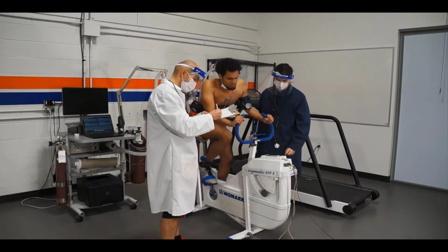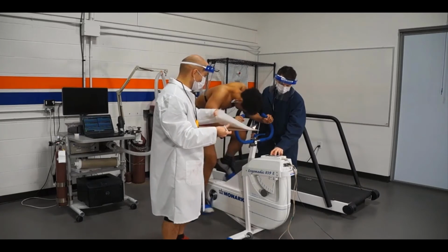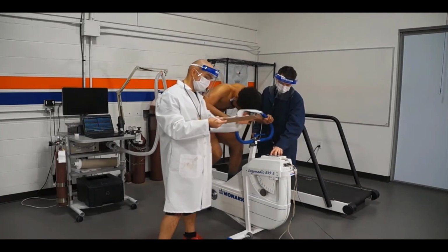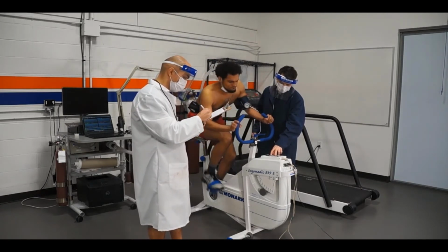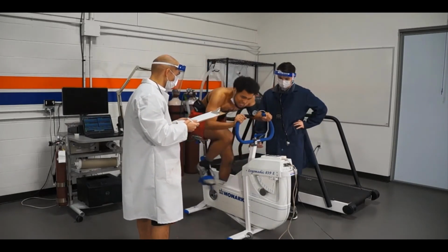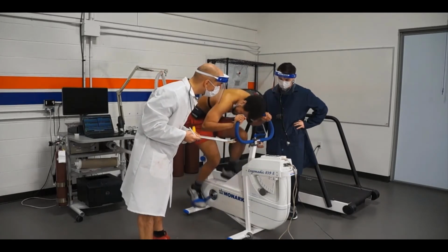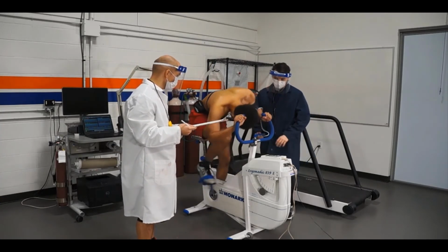Okay, he's back on the bike. He'll finish that up. We'll get our RPE and then increase the workload to the next one. The time does go by very fast in between. Like I said, you're kind of hurry up and wait, but you're managing everything else that's going on, and it's really easy to miss that time and look down and, oh no, you're right at the end of where you're supposed to change the stage and you haven't taken your measurements.